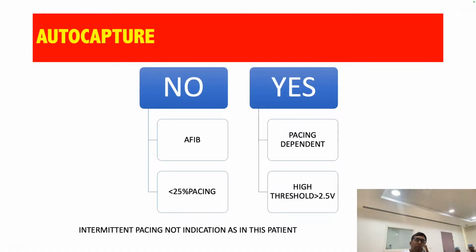So if the patient is pacemaker dependent, where the threshold can go up in the initial part, when we have put the lead and you do not know whether the lead will be stable or not, and you still have a doubt, activate it. It will help, because you have kept it at 3.5, it may be at 5, it may capture, but if you have not kept it, you have lost the patient. So this is the safety system that you can activate for the patient, and wherever the thresholds are high, these are the patients where you have to activate.